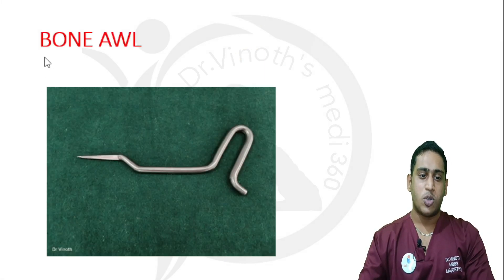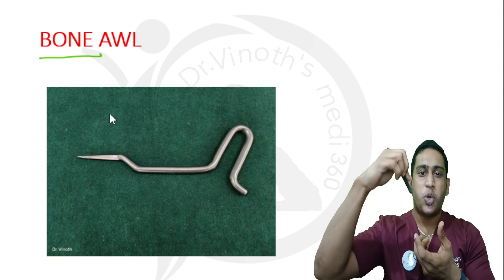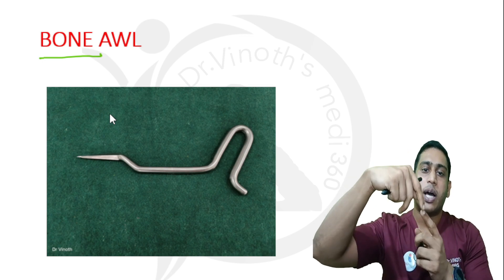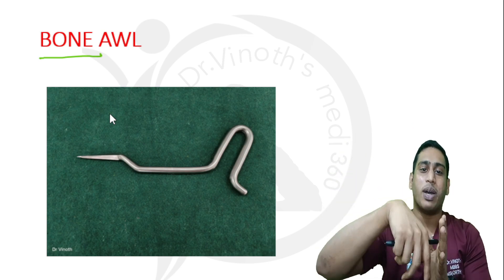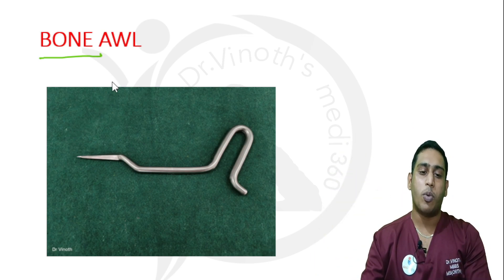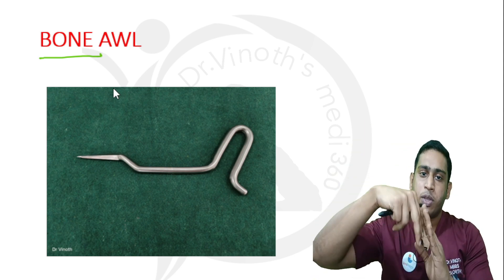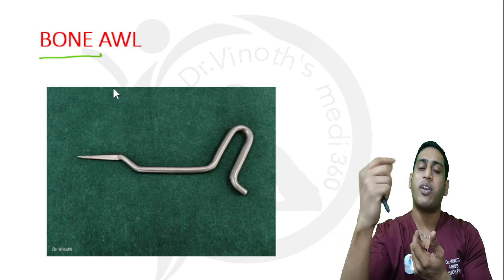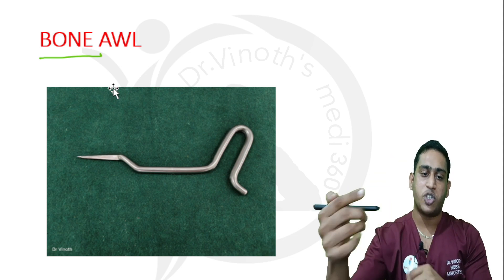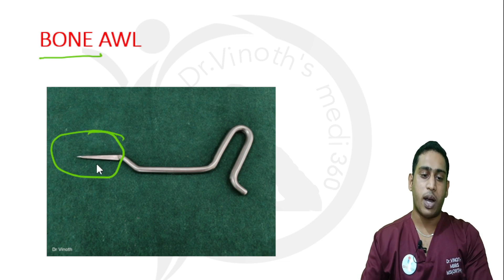Welcome to the instruments. This one is the bone awl. Whenever you are inserting an intramedullary nail, we need to create an opening into the proximal part of the bone so that we can insert the guide wire followed by the nail. To create an opening into the bone matching the medulla — that is, the bone marrow part — this instrument called the bone awl is used, and it is very sharp at the tip.